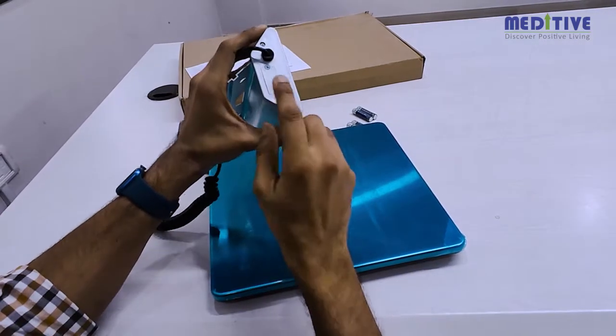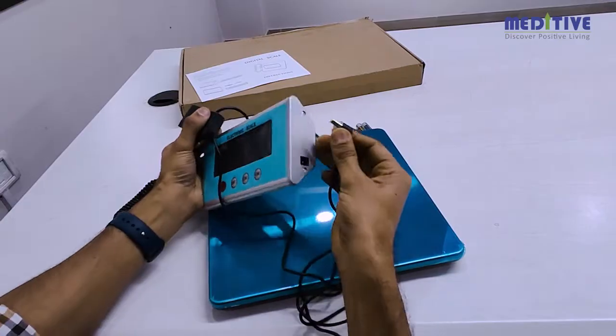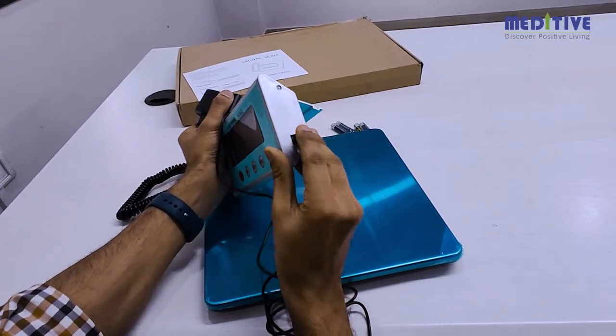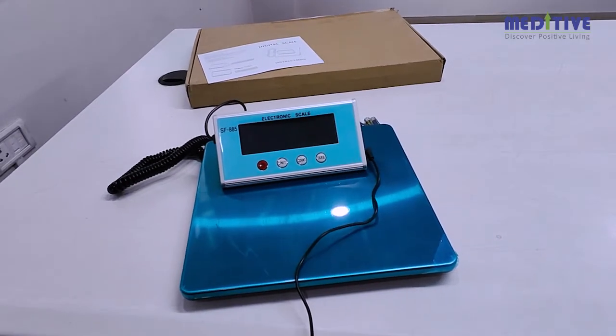The indicator can run on AAA batteries, or alternatively you can also run the indicator on electricity directly using the adapter without the battery. Please note that the adapter will not charge the cells.